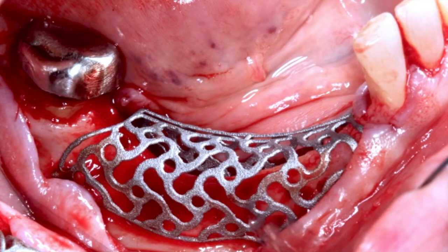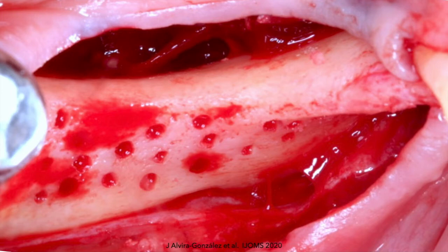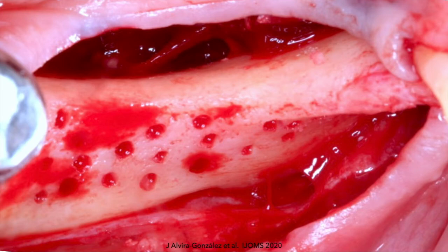We now check the correct fit of the membrane, verifying that our planification corresponds to the clinical position of the membrane. We can appreciate the perfect adaptation of the titanium mesh. We then remove the membrane and perform bone decortication to increase vascularity and blood supply from the recipient site to the graft. Although a recent meta-analysis by Alvira-González and Luca de Stavola found no scientific support for bone decortication in guided bone regeneration, in our opinion it makes clinical sense, especially in the posterior mandible with thick cortical bone.